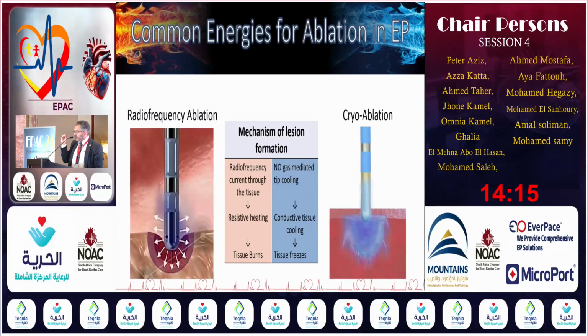And heat is conducted back to the catheter, so you can measure it, and this heat at the interface between the catheter and tissue causes resistive heating, damages part of the tissue, disperses to the surrounding tissue, causes conductive heating, and the dispersion continues until the effect fades away. So heating starts in the tissue and fades from that point onward.